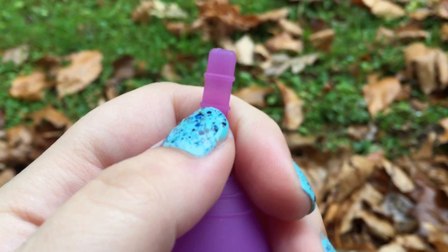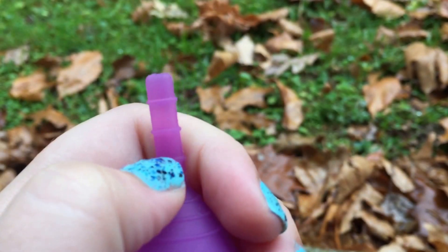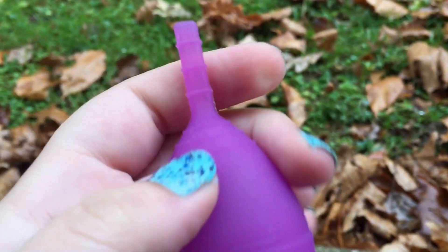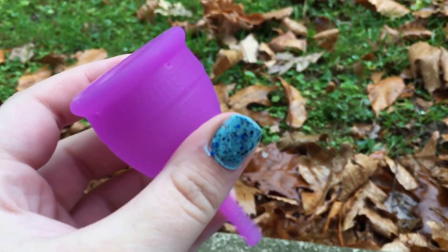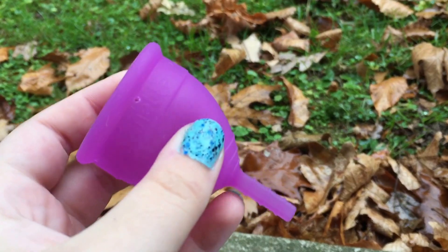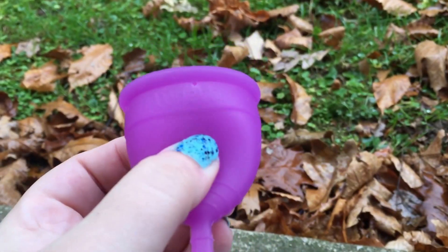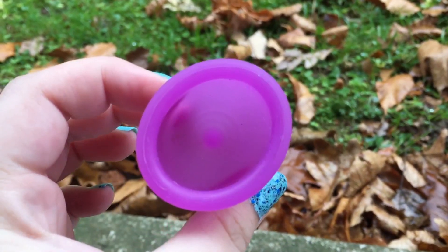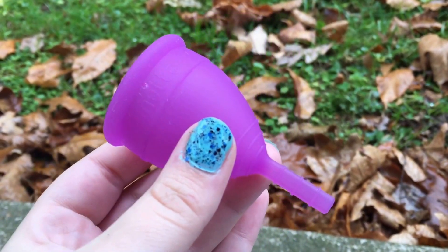It does have kind of a long stem, which I think I'm going to cut off to about right here — this is all I think I'm going to need. Any longer just seems like it might irritate me a little. This is about the size of my smart cup.